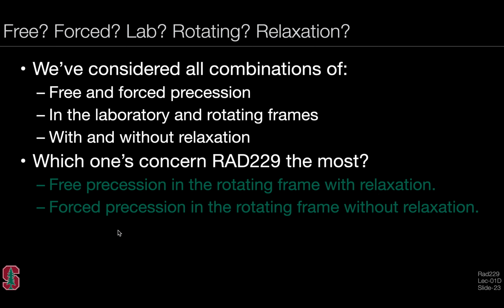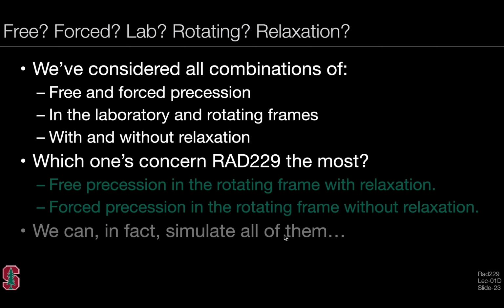We also care a lot about so-called forced precession in the rotating frame, but because forced precession is a short duration event relative to the time constants, T1 and T2, we don't need to always account for the effects of relaxation, especially when trying to work towards analytic solutions and a more intuitive understanding of what's happening. And importantly, you'll note that we principally care about describing bulk magnetization dynamics in the rotating frame. So we can, in fact, simulate all of them, but as the expressions have demonstrated, some of these are relatively complicated and better left to simulation.